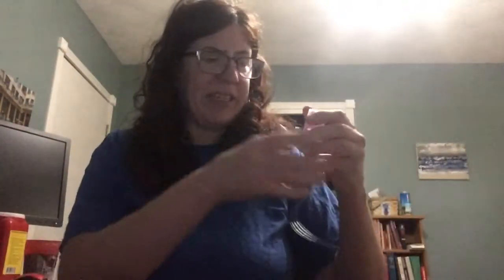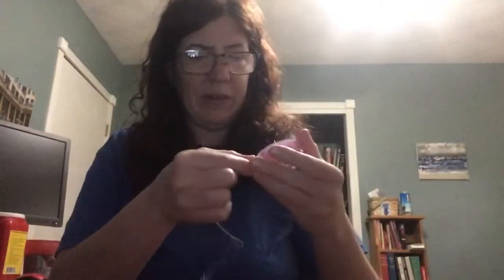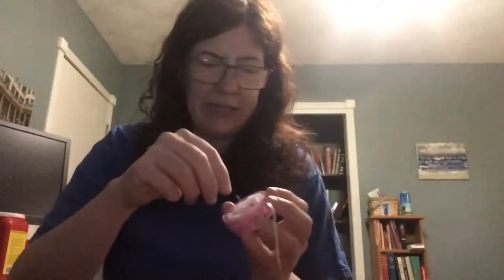It happens. By the way, this is a pink one. I also have gray. My next order will be blue. So this is the AutoSoft 90 from T-Slim. Just want to undo the tubing, or unwind the tubing, I guess I should say. Remove this little cover on the sticky. It's also in a little swirly shape.